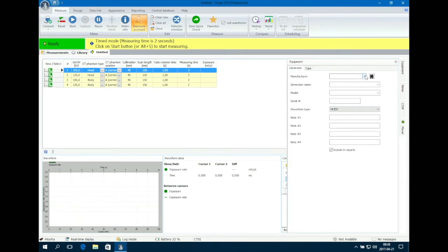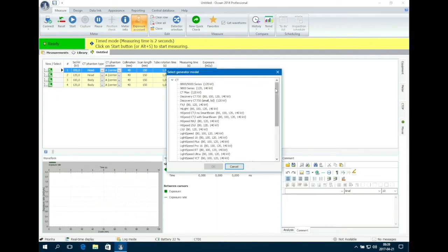This can be done under the manufacturer drop down menu. To specify the model of your CT, click on the binocular symbol and choose the model. Click OK.